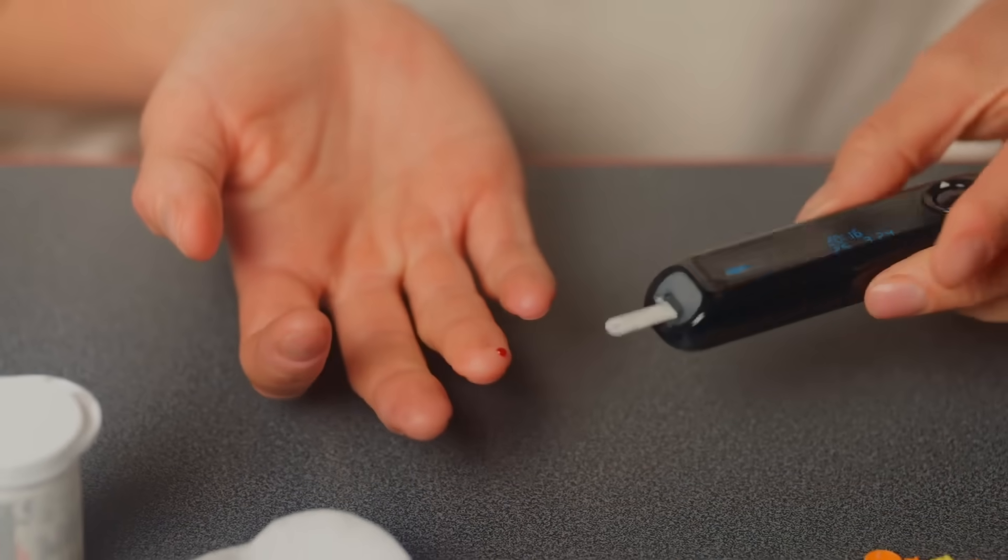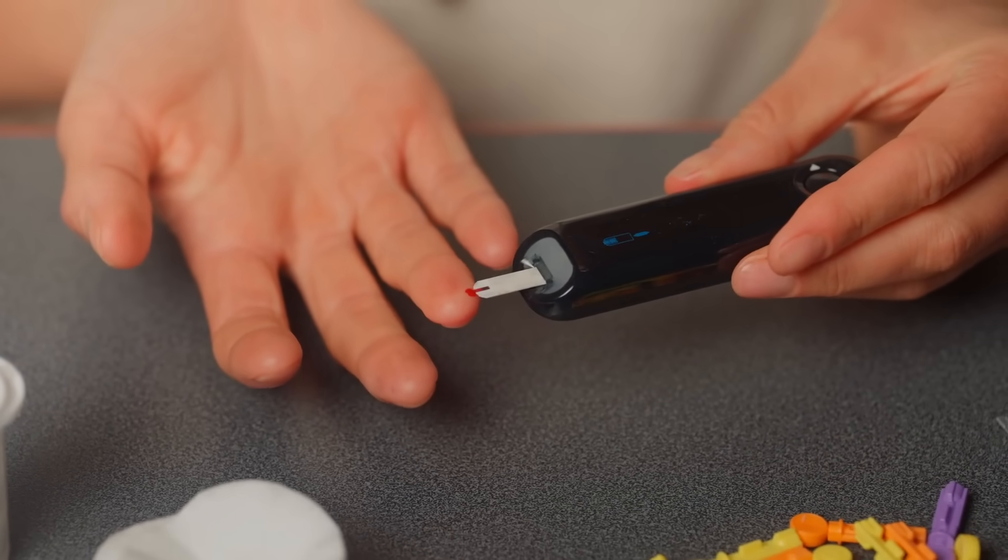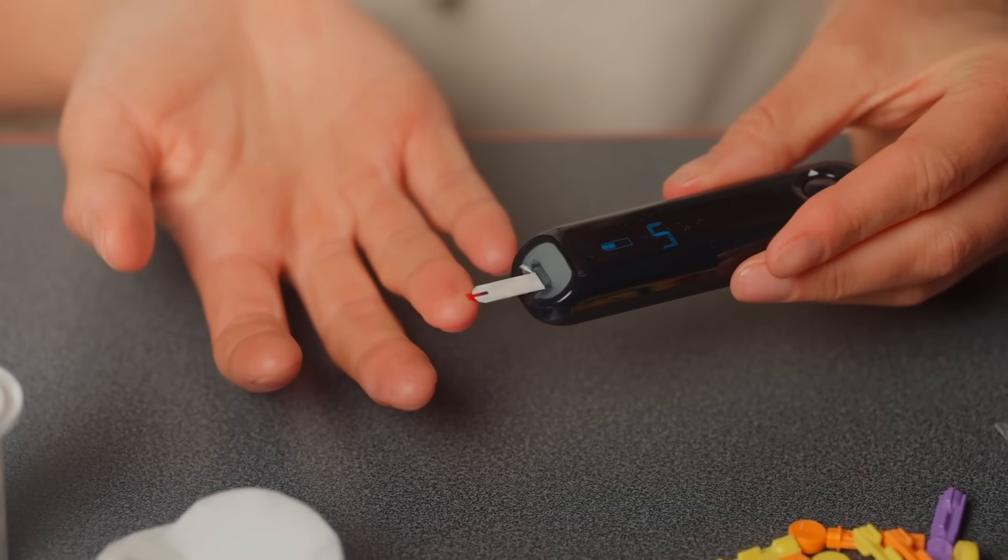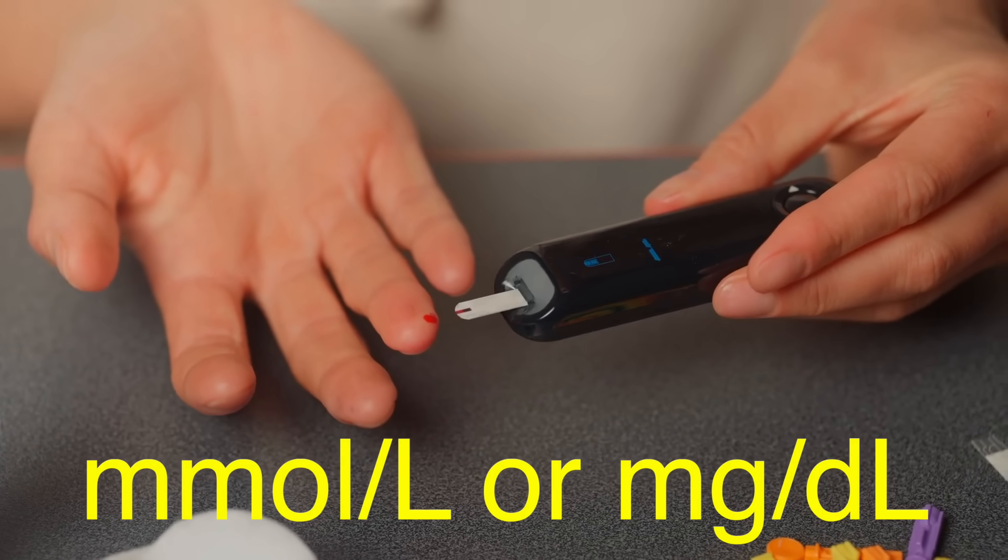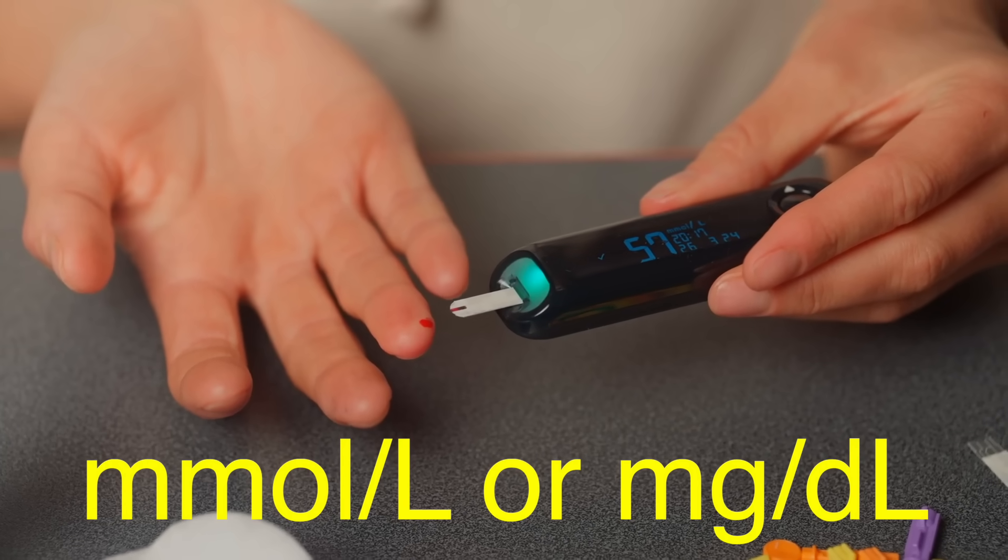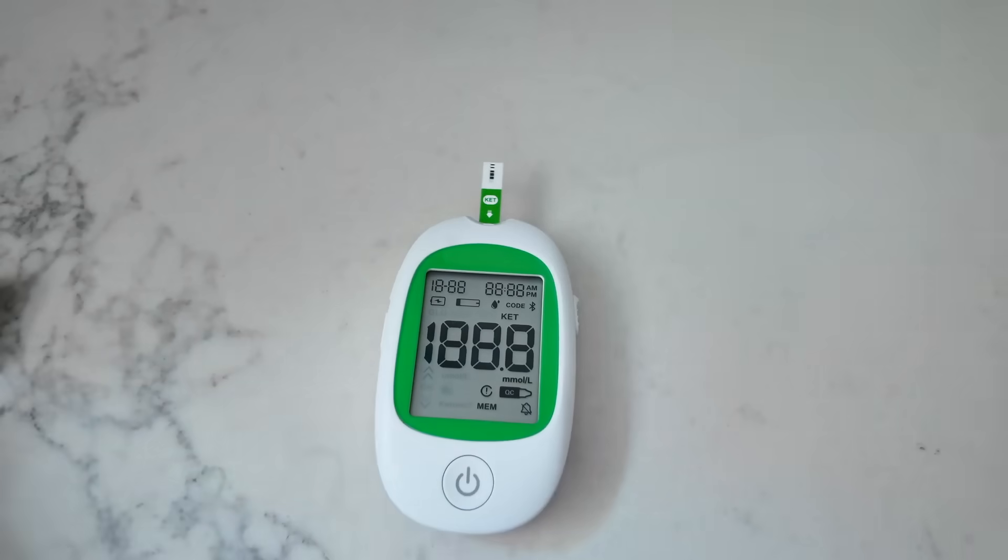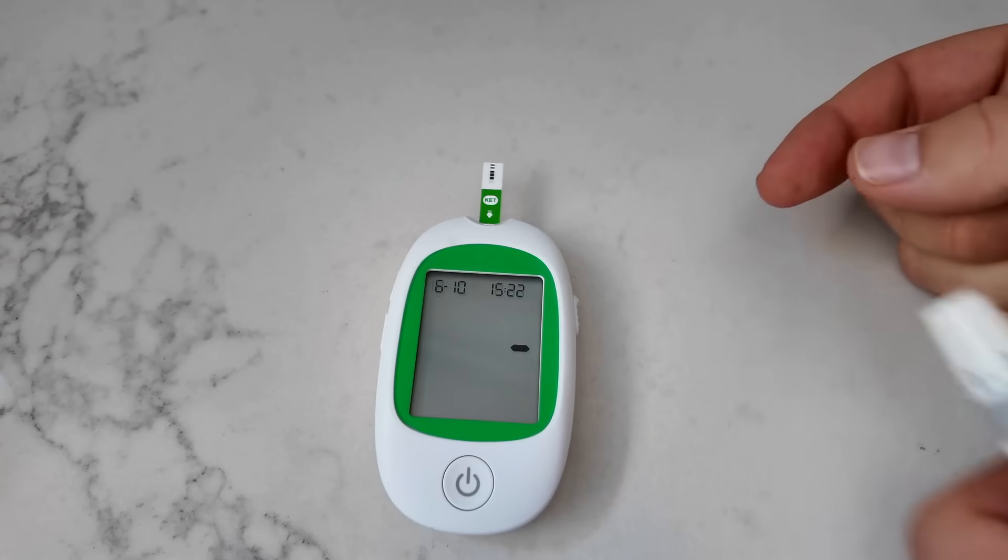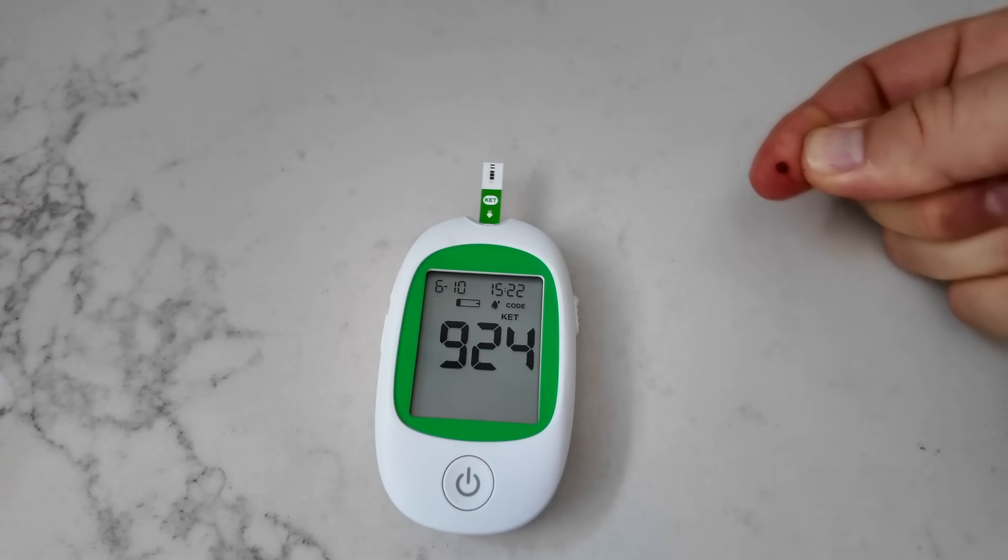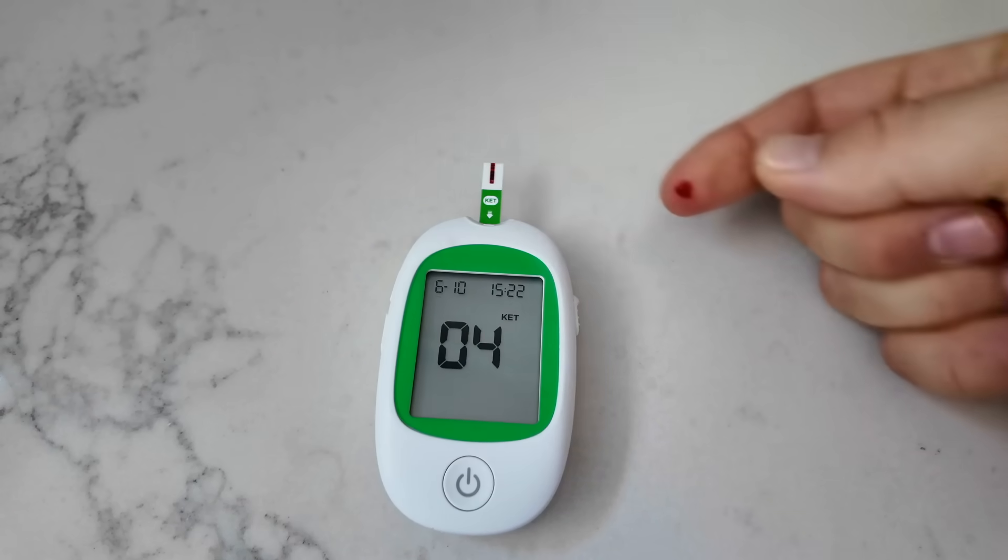The glucose meter's job is to take that electrical signal and translate it into something meaningful: your blood sugar level, displayed in millimoles per liter or milligrams per deciliter, depending on where you live. Inside the meter, a microprocessor analyzes the signal and performs calculations based on the specific characteristics of the test strip and the enzyme used. The entire process, from blood sample to result, takes about 5 to 10 seconds.